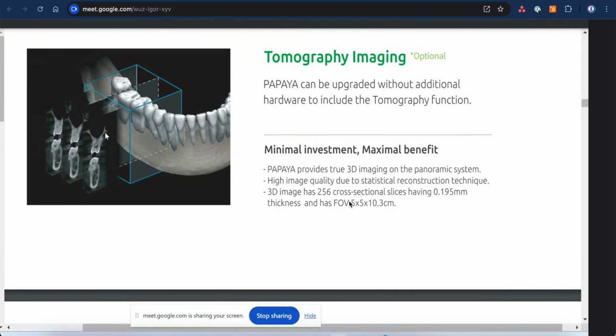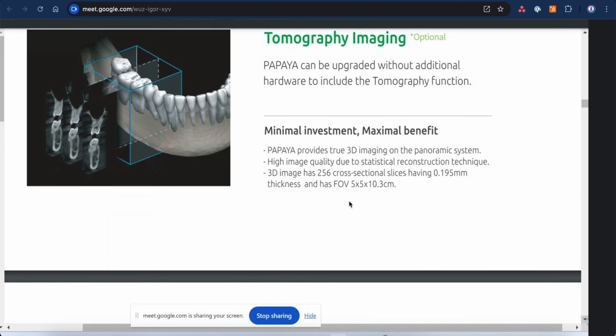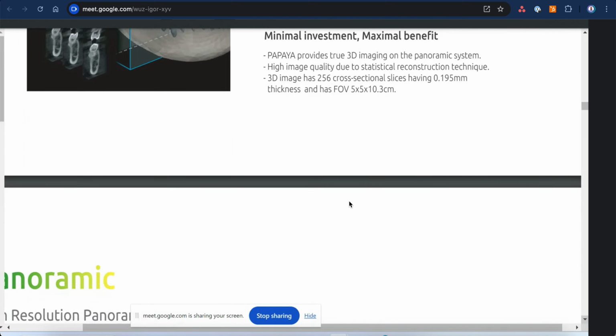This is cost, because it's in the software. This is something done in the software, so it is a software that is updated. It's not something individual like the cephalometric or the panoramic. No, this is more like software. I can get the X-ray exposure, for example, for these 5 teeth, and then I can do the tomography in the software on the computer, using the mouse.